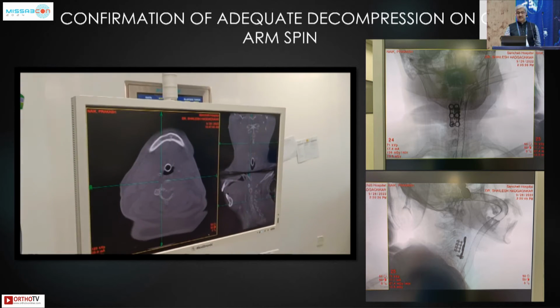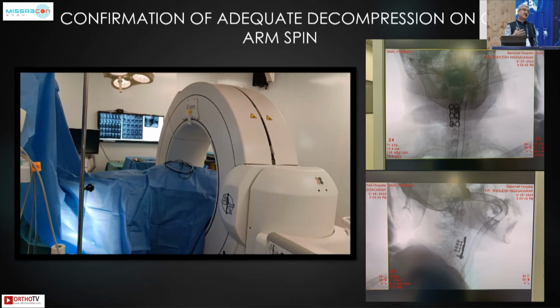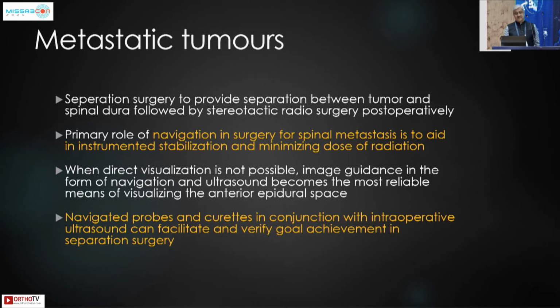After the first stage of the surgery, we took the O-arm navigation to see the adequate removal of the lesion, and it was followed by the posterior pedicle screw fixation in the cervical spine. That's the final post-op X-ray.